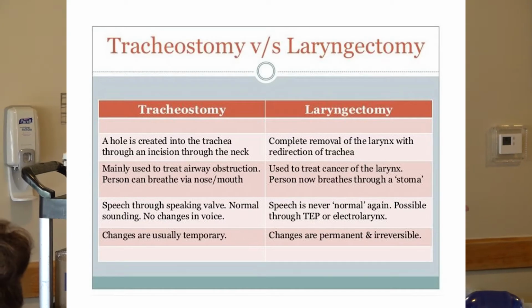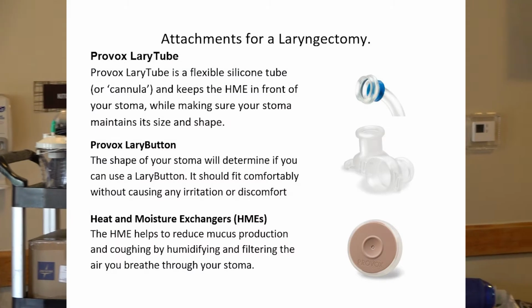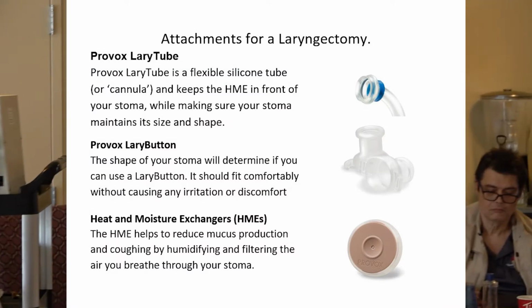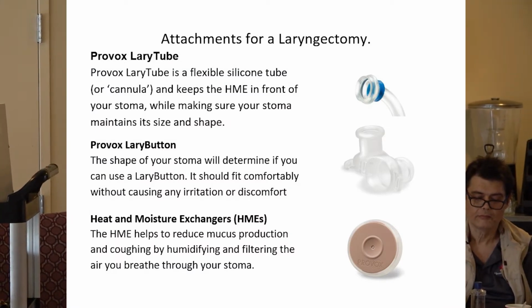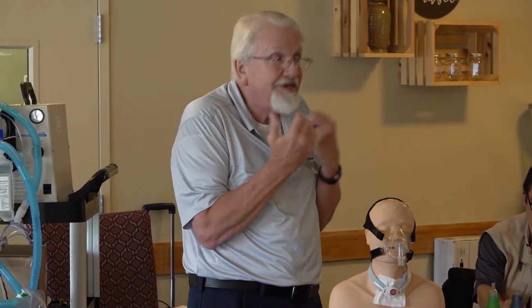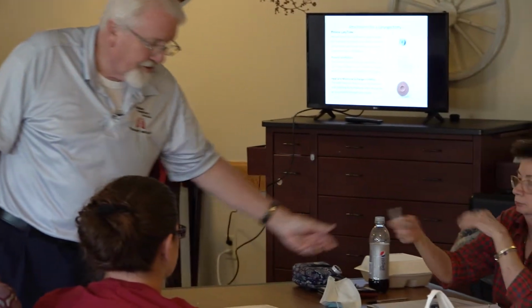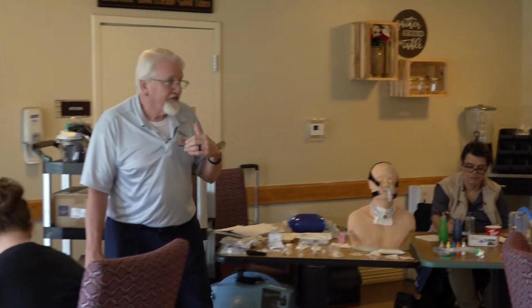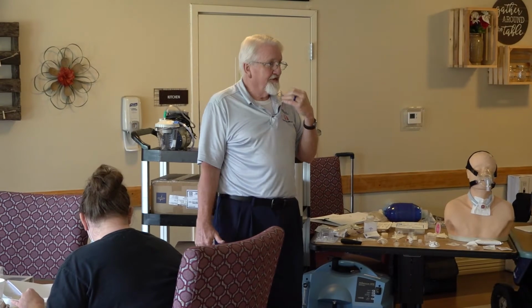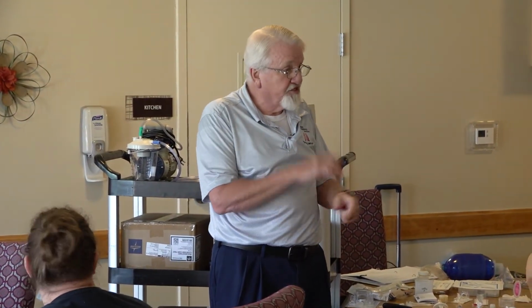And there's just a couple of comparisons on that previous slide. So with the laryngectomy patient, like I say, don't be intimidated by the laryngectomy. They're easier to me than doing a trach patient. So this here, if you just take a look at it, pass it around right quick, that's called a Lary tube. So a patient that has a laryngectomy done has a couple of options.